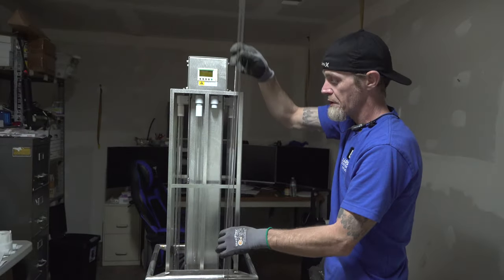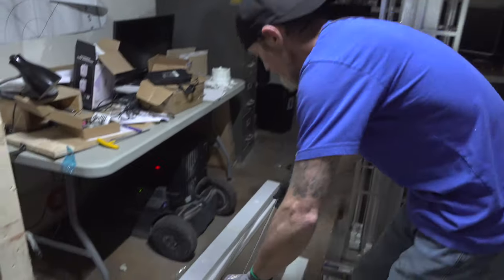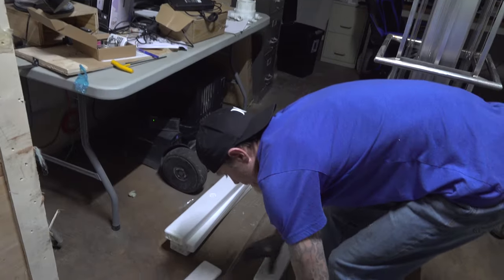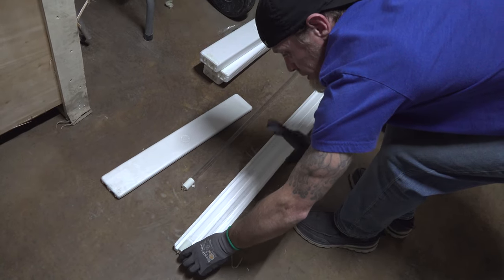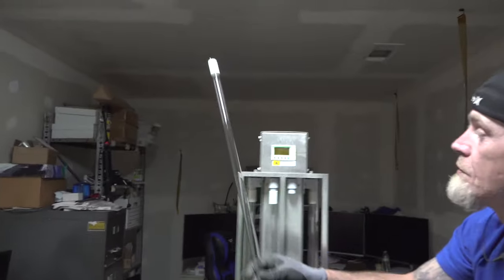Simply slide the bulb completely out of the top cage. Now you are ready to install your new UVC lamp — again assuring that you wear gloves. You simply reverse the process.